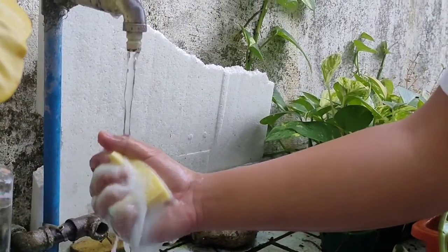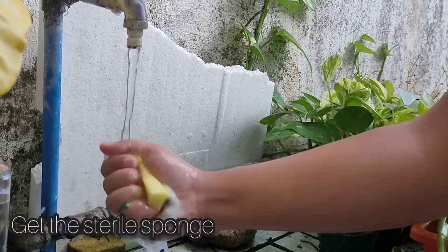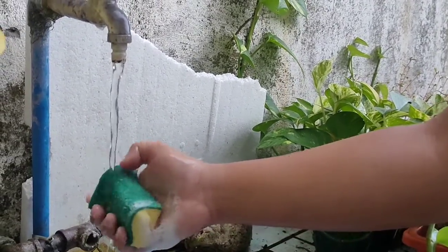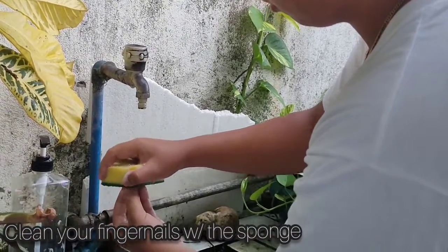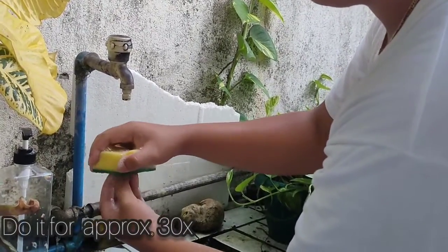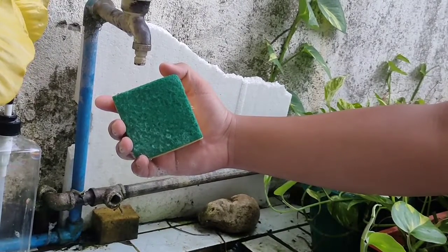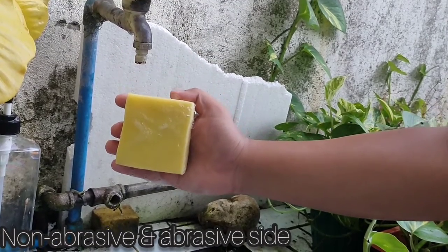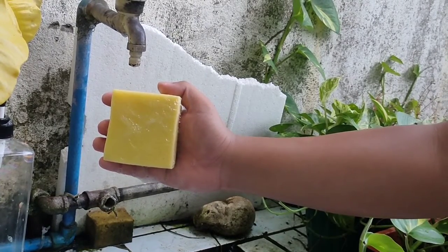After rinsing our hands and arms, it's time for us to get our sterile surgical sponge and moisten it under the running water. Use a light but firm pressure to stroke the nails in a back and forth motion with the abrasive brush side of the sponge, approximately 30 times. Always remember that the abrasive brush side is only used on your fingertips. The non-abrasive side should be used for the remainder of the scrub.